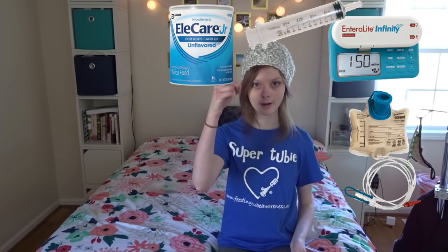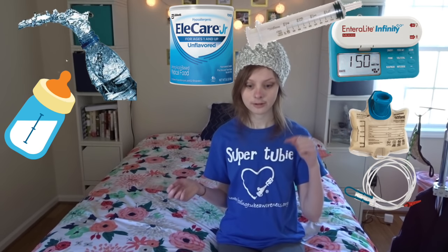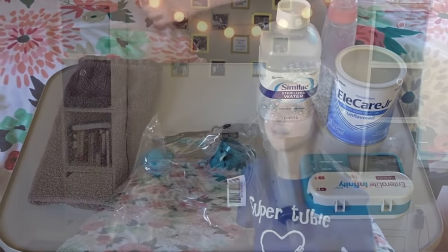The first part in preparing a feed is gathering your supplies. You will need a pump or a syringe, a feed bag that goes with your pump, your formula, your water, a bottle to mix the formula in, a clean extension, and a towel if you're like me and always make a mess.